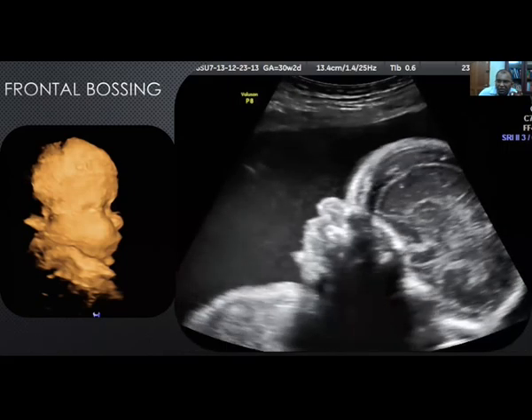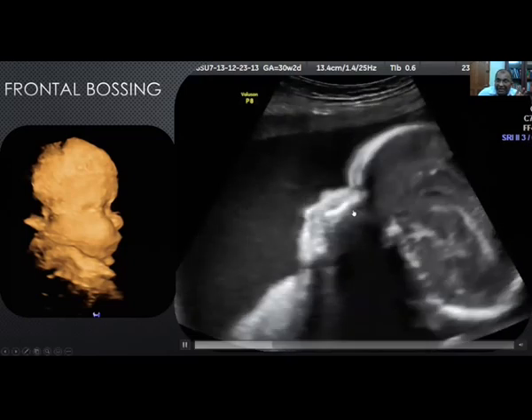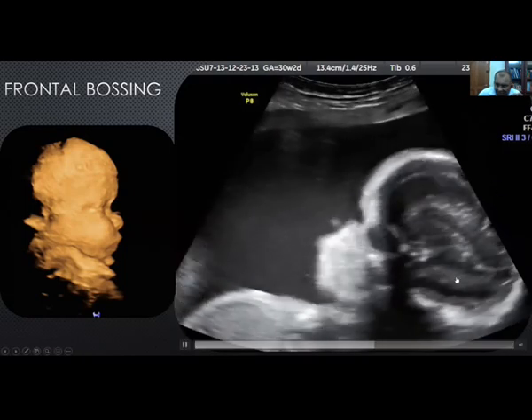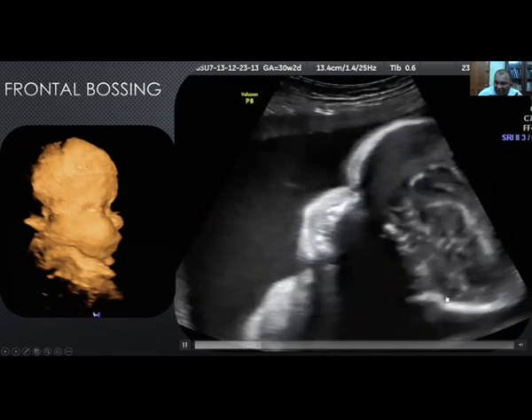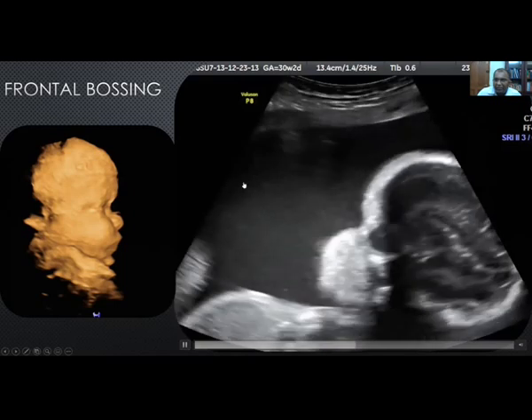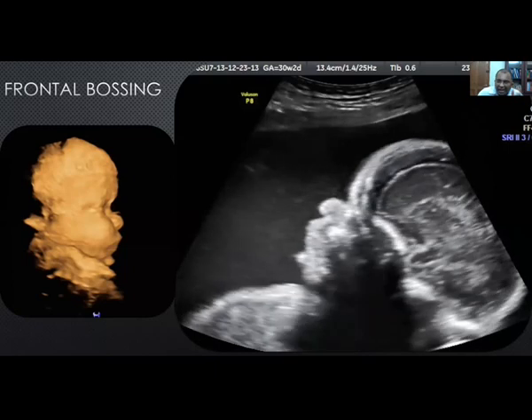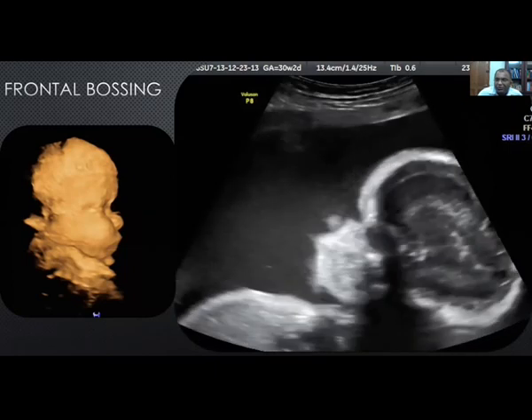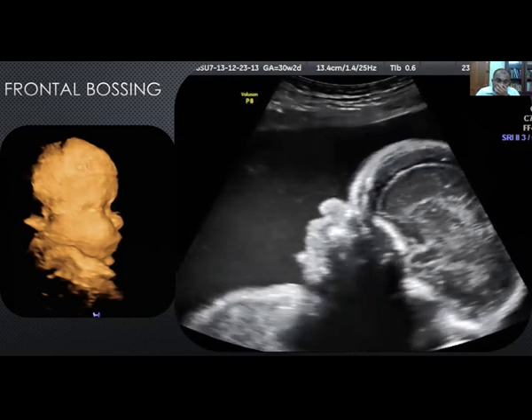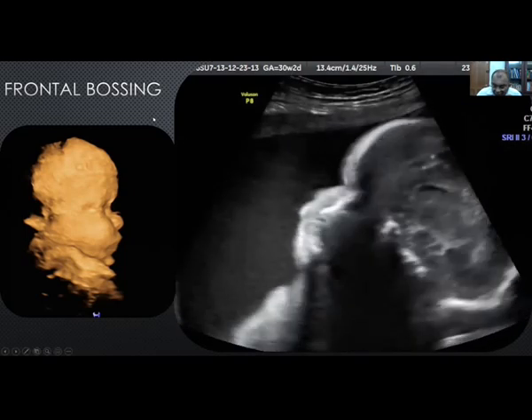One point to note in achondroplasia is that most often it will have a near normal 20-week scan. There will be a marginal increase in size of the head or the cranial parameters, and borderline normal femur length. For example, if it's a 20-week scan, it will be 18.4, 18.3, but it will not be really short, because achondroplasia presents itself between 21 to 27 weeks dominantly, and you can easily pick it up only after 24 weeks. Before 24 weeks, it cannot be easily picked up, and we need to be aware of this.